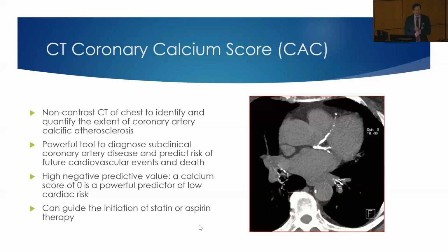So it's a non-contrast CT, so it's not as dependent on your heart rate, and you don't get IV contrast, so it's not like a coronary CTA.